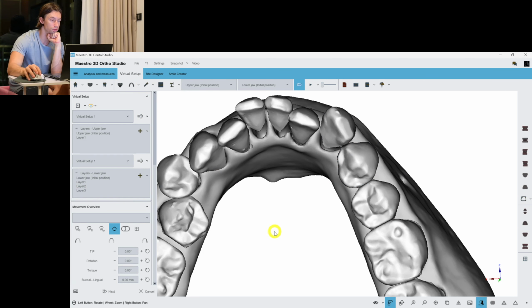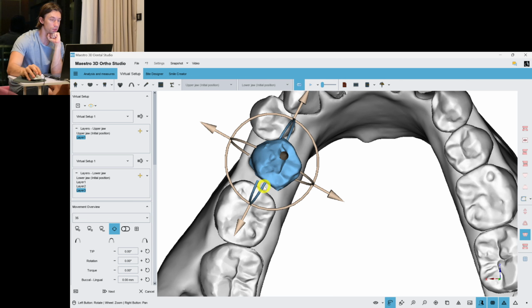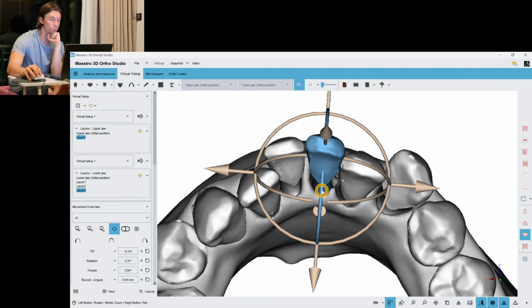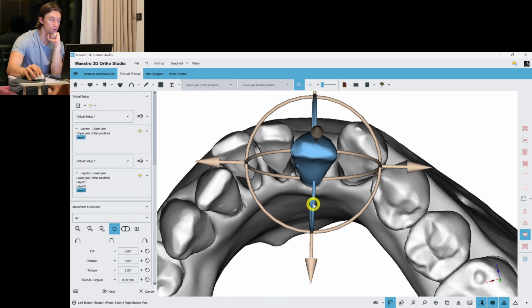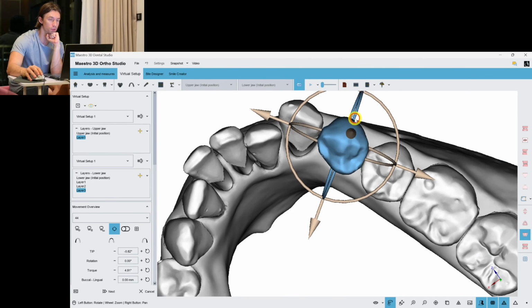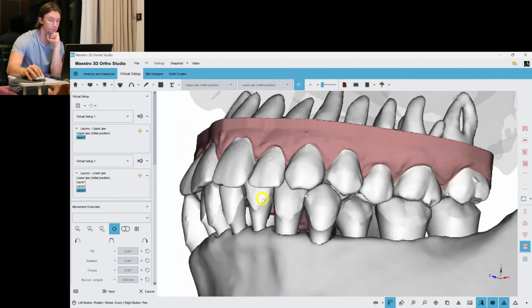Layer 3. So I place the molar to the final position. And I can start making a distal tipping for the second premolar. And proceed with the tipping, with vestibular tipping of the frontal teeth. Here are some mesial tippings. Since we have some anchorage, it's an okay movement here. Let's check the root. We're inside the bone, it's good for us. Add some more expansion. Okay.